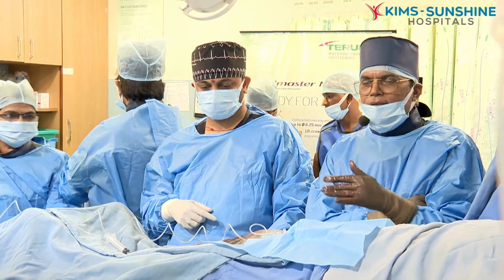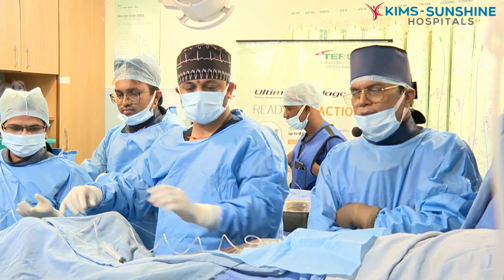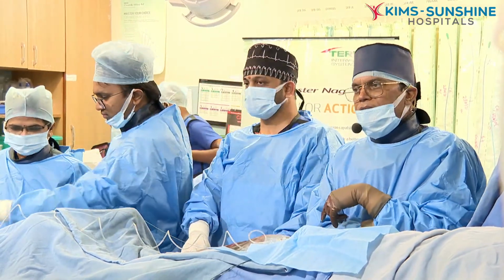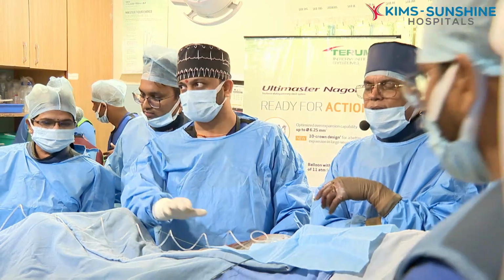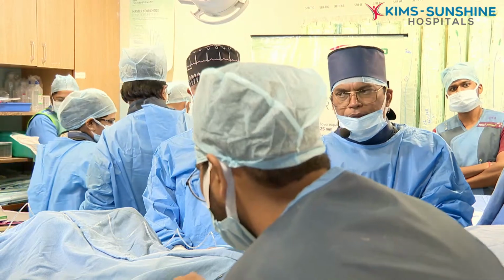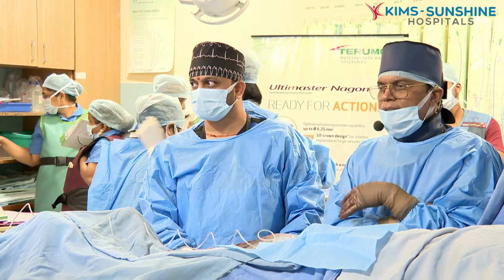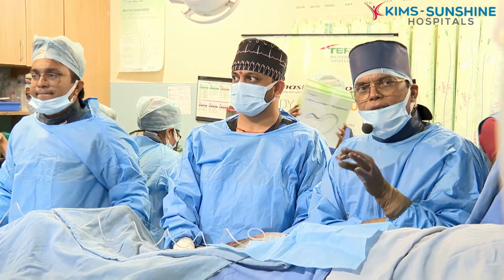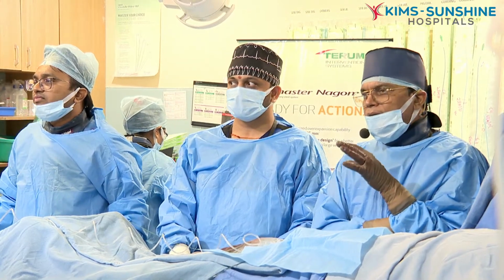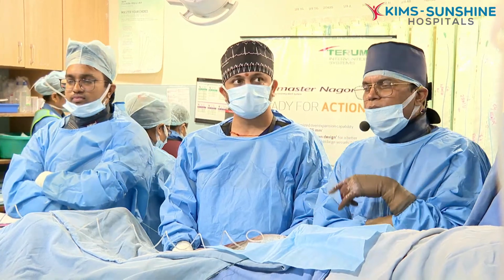Then subsequently, distally we dilated with AngioSculpt. In the mid LCX we put a 24 into 2.75 mm stent, and from LM to LCX we implanted one more stent, a 24 into 3 mm stent. Then we did an IVUS study of the LM, LAD and LCX. LAD showed a mild minimal area at the ostial LAD. LM to LCX is about 5 square mm and LAD is about 8 to 9 square mm.